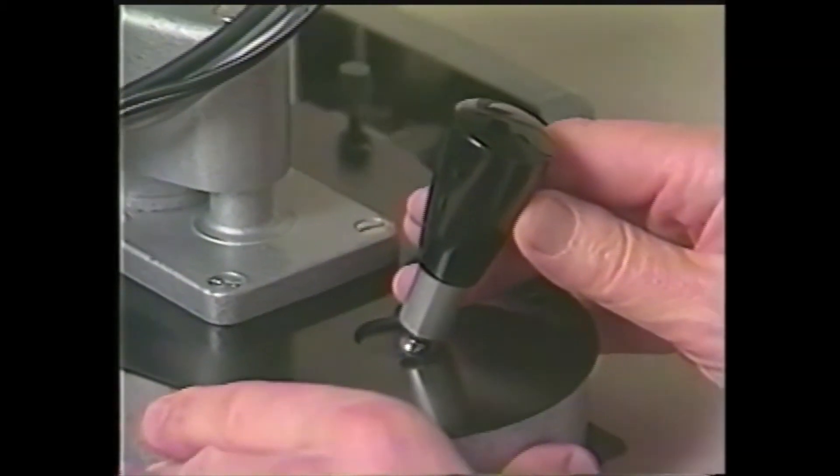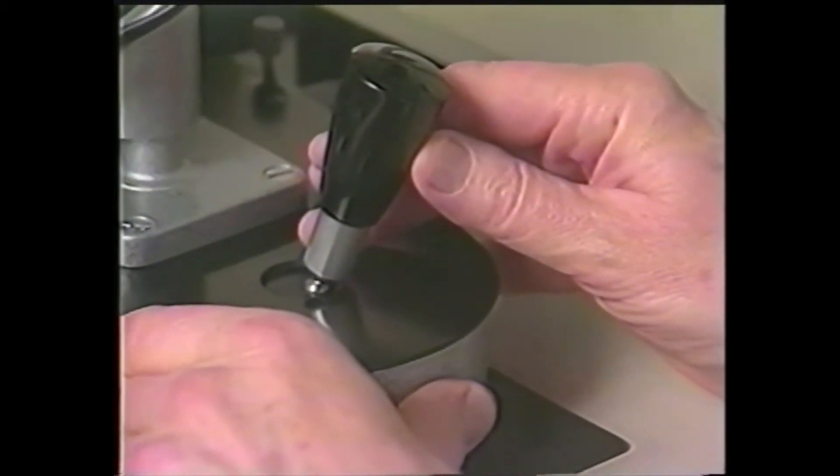Gently move the slit lamp carriage with both hands towards the eye. If the patient withdraws, have them look down and gently lift their eyelid and hold it against the brow. Guide the tonometer and slit lamp carriage with your free hand to almost touch the eye.